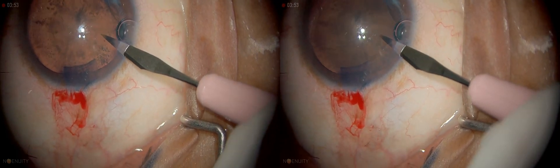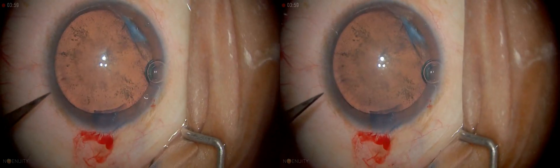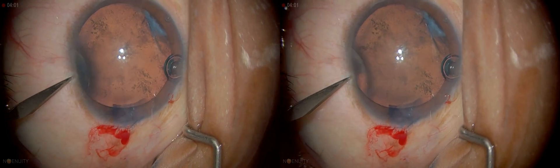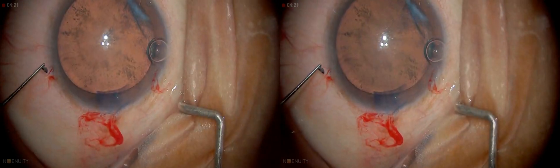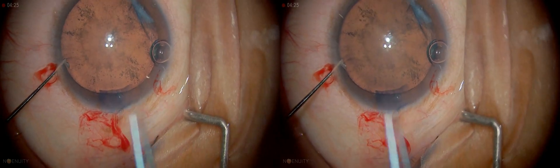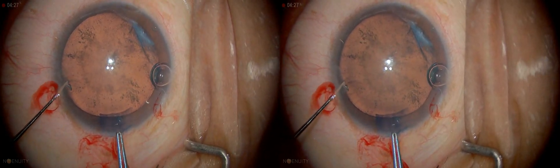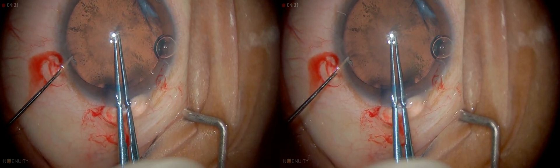Now this is the side-port incision. Again, it's very controlled. Then we're going to do another one. We're going in gently — I'm going to make a slight depression. You can see that depression nicely.